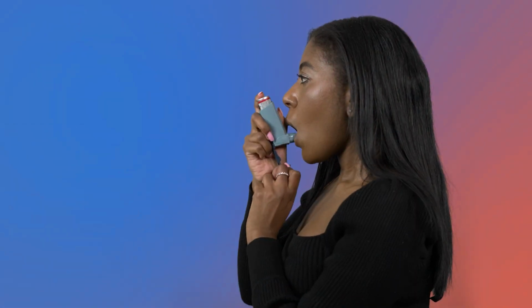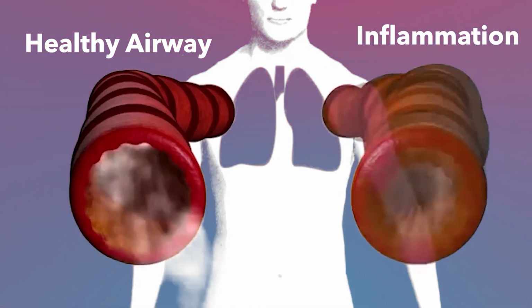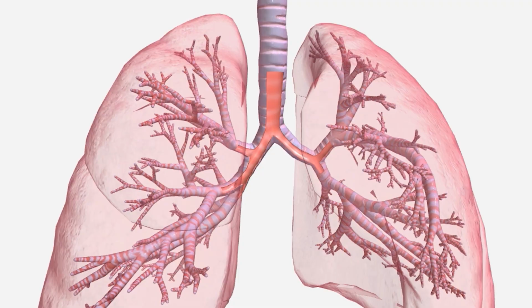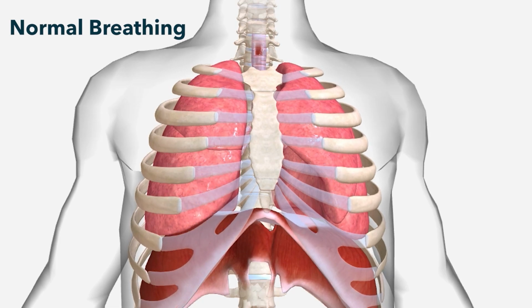Every time you use your usual rescue inhaler for asthma symptoms, take a puff of the PARTICS inhaler for each puff of your rescue inhaler. This PARTICS inhaler is an inhaled corticosteroid which decreases the amount of inflammation in your lungs. That inflammation causes your lungs to be sensitive, makes you have asthma attacks, and causes asthma symptoms. Reducing inflammation reduces asthma attacks and decreases symptoms so you can breathe better over time.